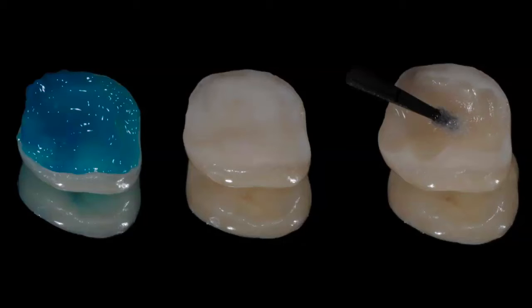That's a salt that is produced as a consequence of the etching of the glass. And right after this, you don't see this in this photo, but right after this step, I'm going to place this restoration in a small plastic container with some isopropyl alcohol, and I'm going to seal that container, and I'm going to put it in my ultrasound for 5 minutes.